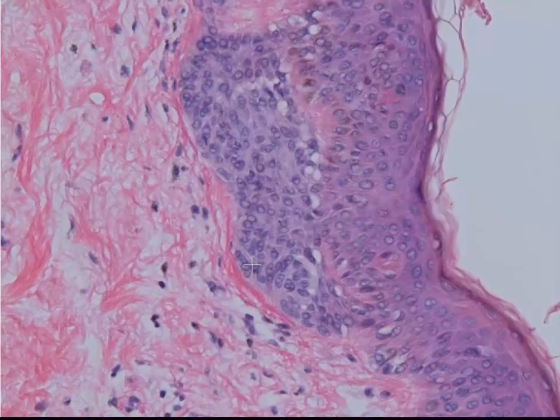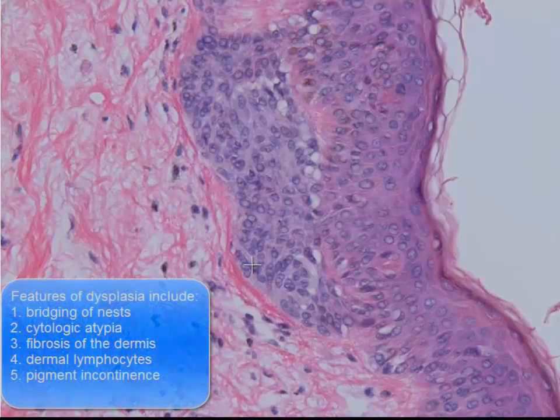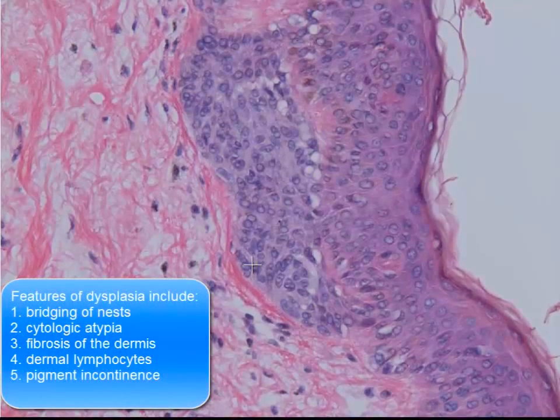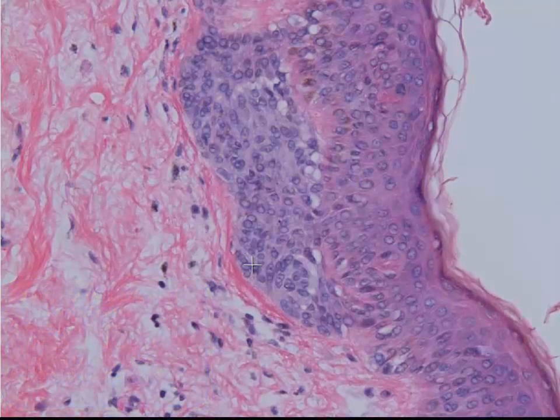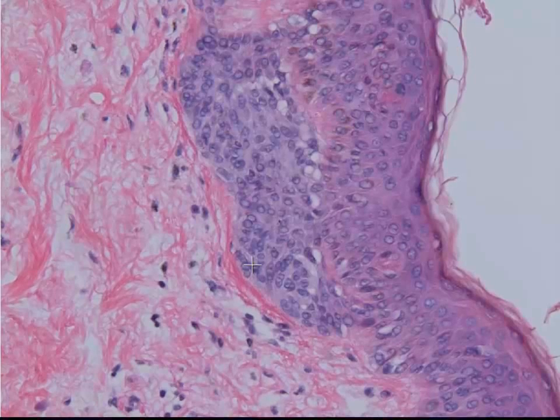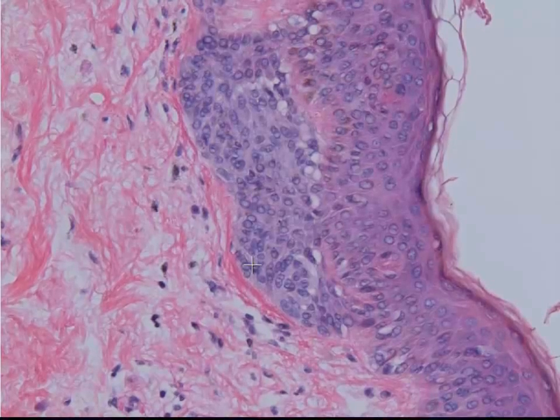Bridging is a sign of dysplasia. This is a case of mild dysplasia, but dysplasia nonetheless. So this is an example of one end of the spectrum — the benign end — a mildly dysplastic nevus.